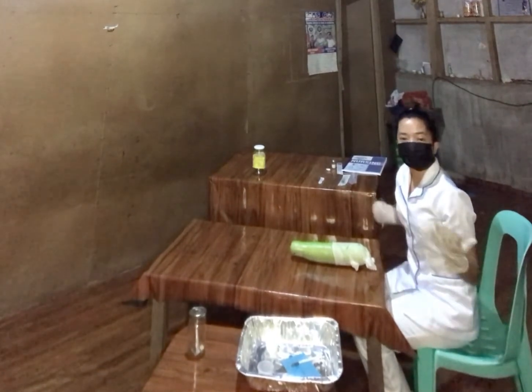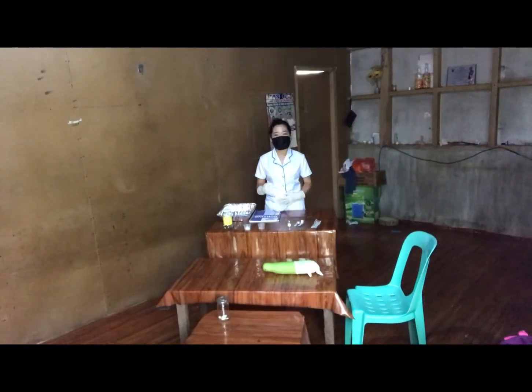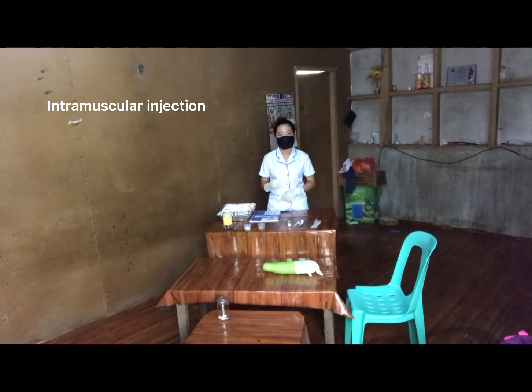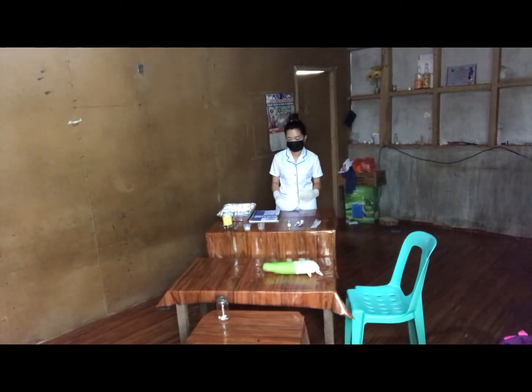Now we are done with the intradermal. So we are done demonstrating intradermal injection, and this time we are going to demonstrate the intramuscular injection. So intramuscular injection is the introduction of medications deep into the muscle tissue where a large network of blood vessels can absorb it readily and quickly.